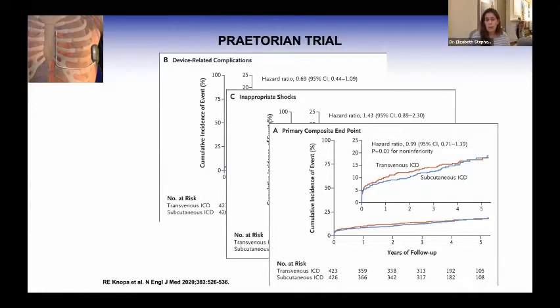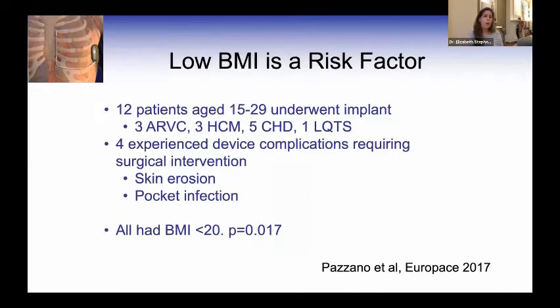And I think this reminds us that what we really need to be doing here is deciding which device is right for the individual patient in front of you. One of the things to think about is how large your patient is.